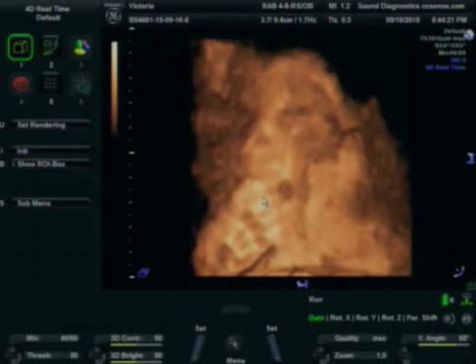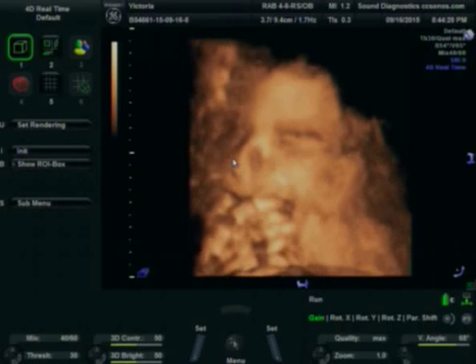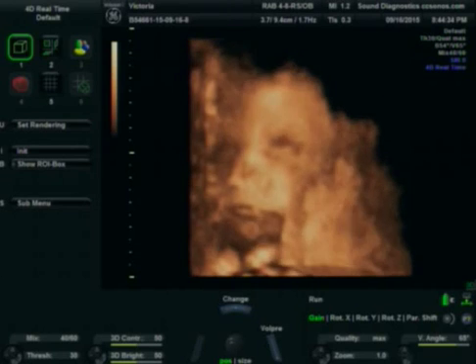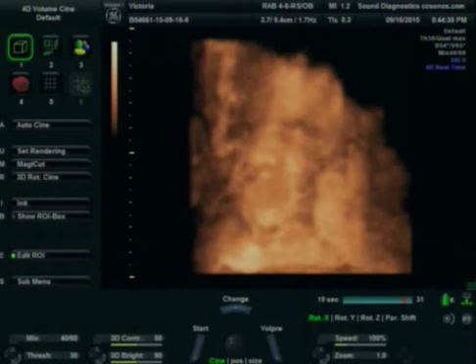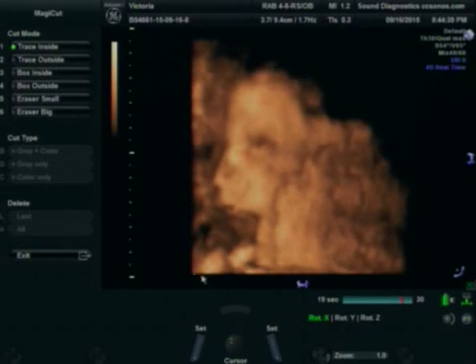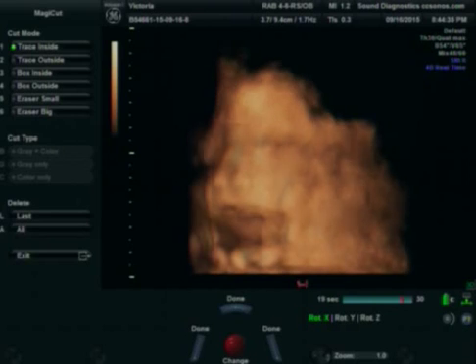Eye, nose, mouth, and there's that hand going all up in it. So you see the nose is even getting smushed because the baby's decided to be nice and close to the side of the uterus there. Kind of like if you were pressing up on the inside of a glass window or something. Let's see if we can fix this one up here a little bit. Turn to the side. See if we can't trim away some of that uterus. Turn to the other side.